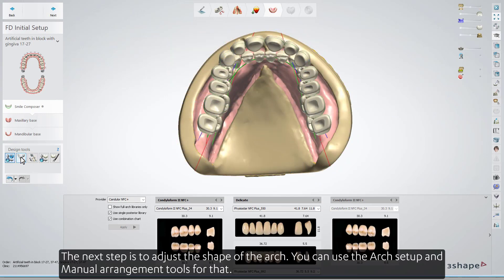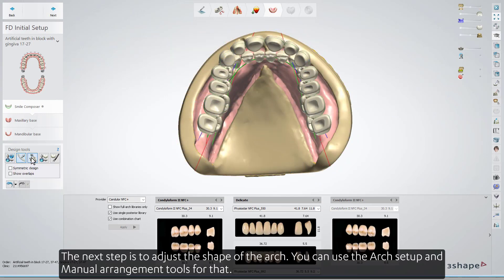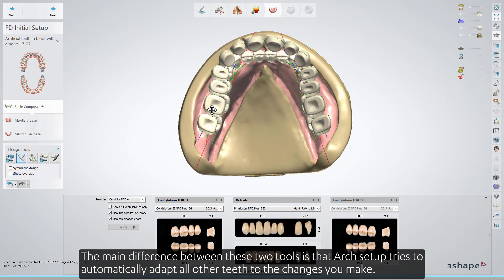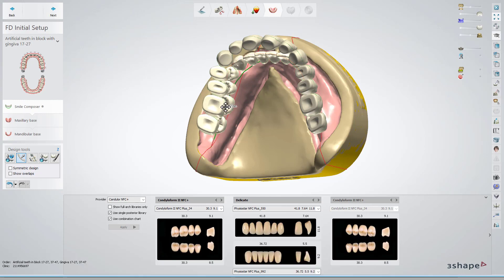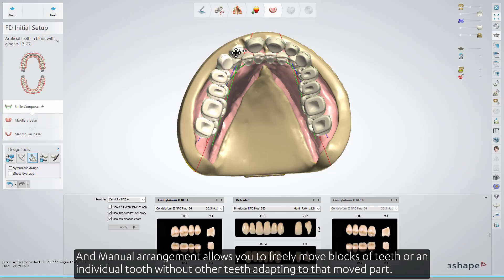The next step is to adjust the shape of the arch. You can use the Arch Setup and Manual Arrangement tools for that. The main difference between these two tools is that Arch Setup tries to automatically adapt all other teeth to the changes you make, while Manual Arrangement allows you to freely move blocks of teeth or an individual tooth without other teeth adapting to that moved part.